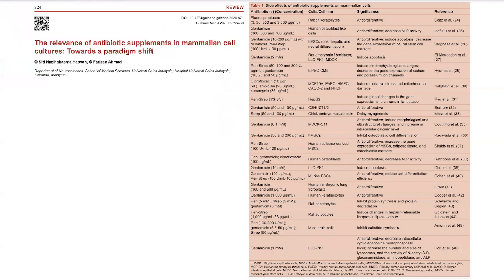They're not the only paper to have found differences. A review article shows the kinds of differences found with the use of different antibiotics and different cell lines. A lot of them are anti-proliferative — they can prevent the cells from growing — and some induce apoptosis, basically causing these cells to kill themselves, while others induce changes in gene expression.